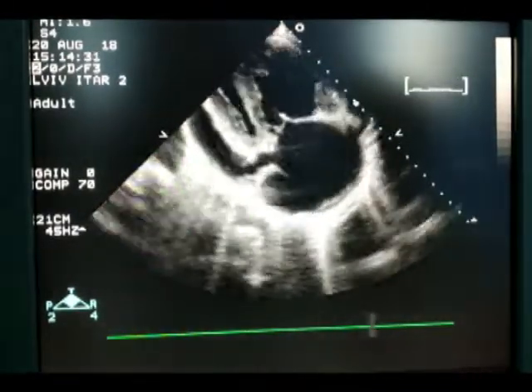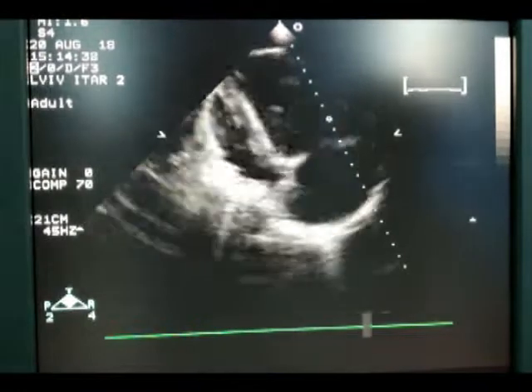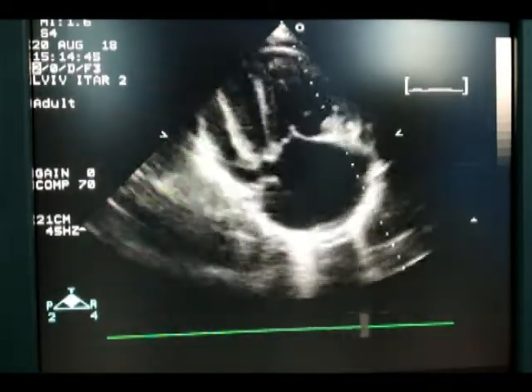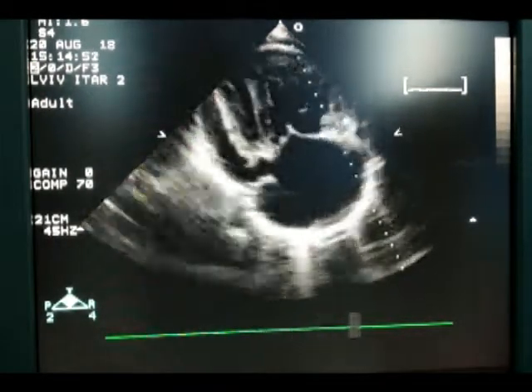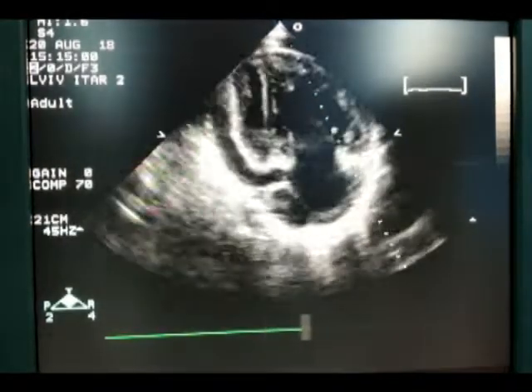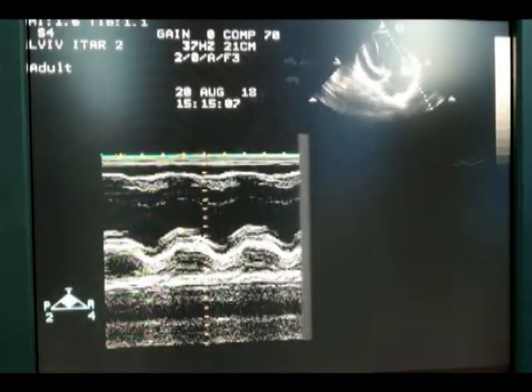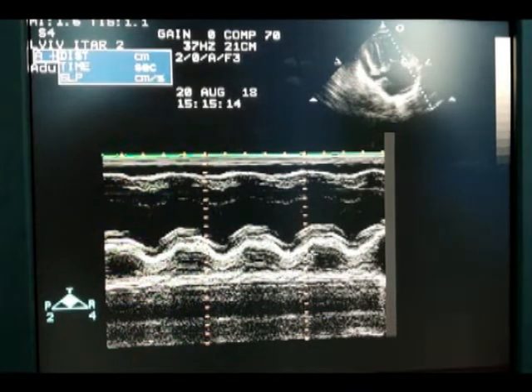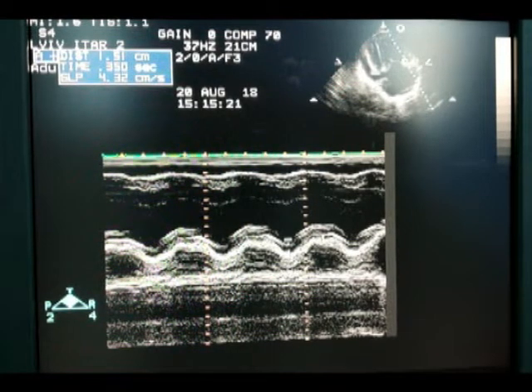Now we use the standard method of assessment of right ventricular systolic function: TAPSE — tricuspid annular plane systolic excursion. We activate M-mode and align the beam across the lateral part of the tricuspid valve ring. We measure the distance: 1.5 cm. This is abnormal — it should be more than 2 cm. So the right ventricular systolic function is depressed.